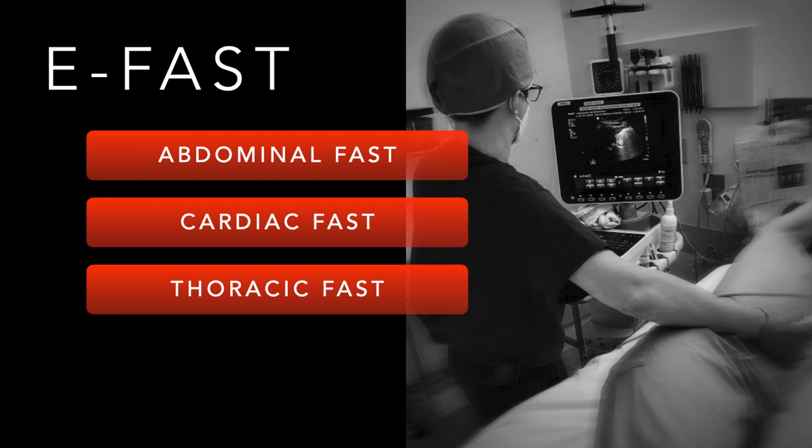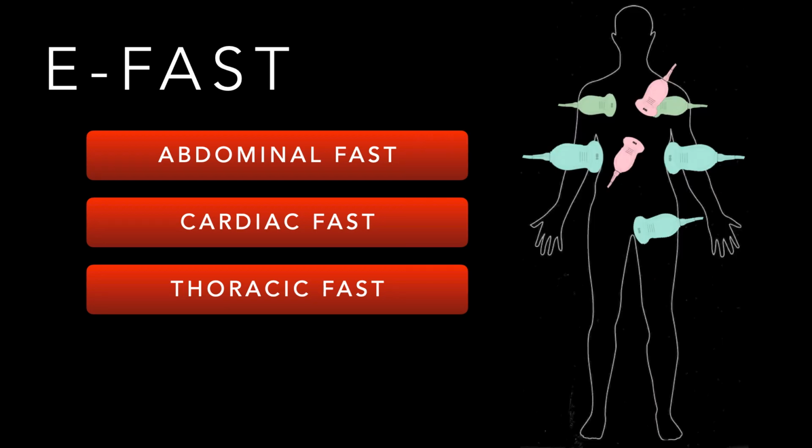And so I'll leave you with this image, just kind of showing the whole thing all at once. I like to consider them like books on the shelf, right? You have the 3 different books. You can mix and match. You can use the different windows to give you the answer that you need for your specific patient.